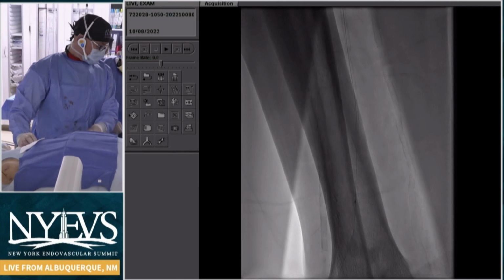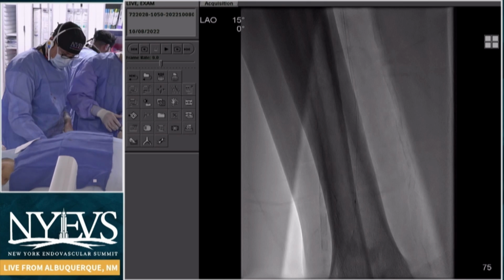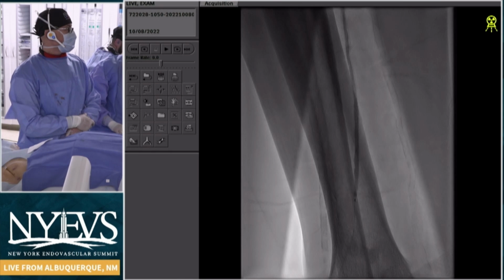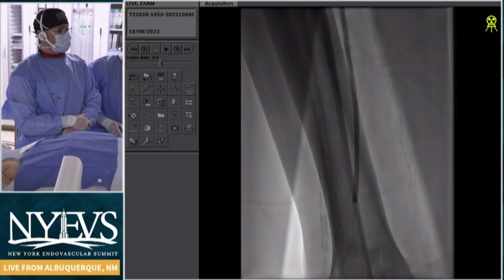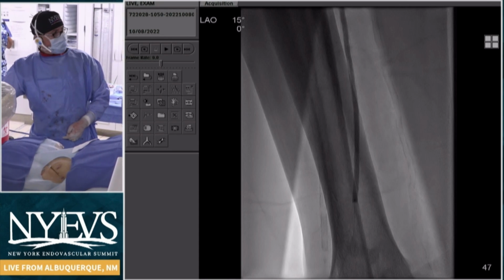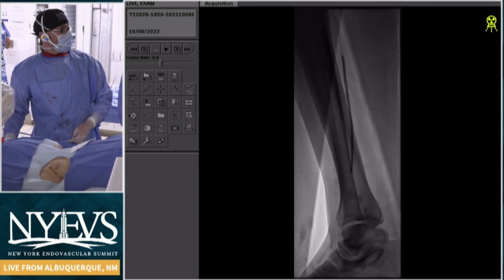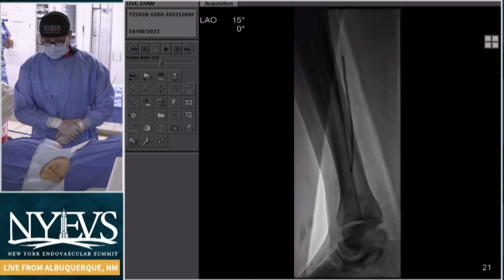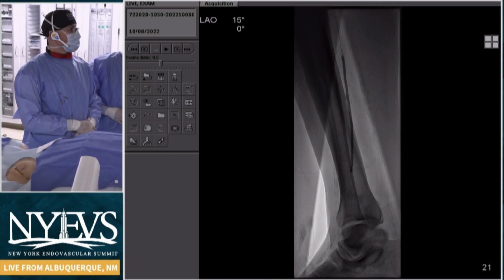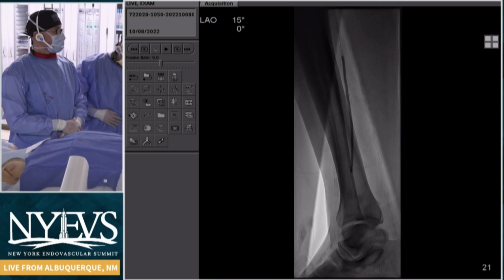Can you tell us what you're using, Brian? What machine, what software? Are you talking about the Siemens perfusion imaging or Philips, or something else? Philips. Yeah, we have the Philips, their newest system. We have that all integrated into two of our hybrid suites. How about you, Dr. Finelli? Yeah, we use the Philips system, but because I think this could be useful, we are still trying to understand the value.